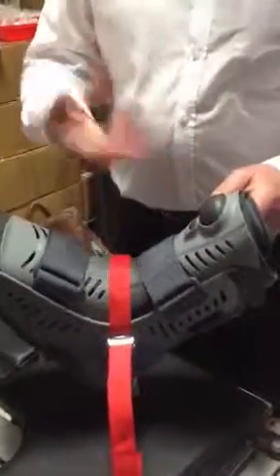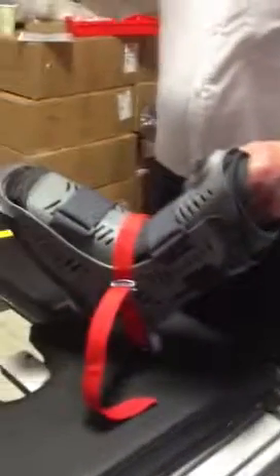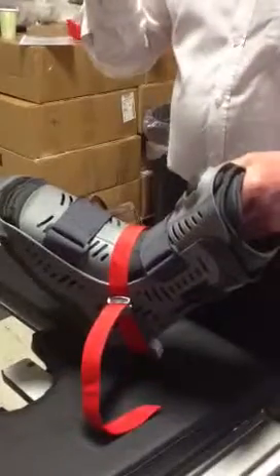It's worth trying on and pumping it up and feeling it on yourself, so you then know what you're doing to the patient. Because the patient, of course, is unconscious. You're not going to get any feedback from the patient. And that's universal left and right? Yeah. And the smaller size is good up to about a lady's size 6. So there's an overlap between the two.